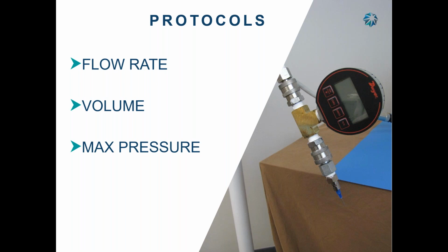Now you notice that these injectors up here are kind of torn apart a little bit, but they have an A and B. The CVI, did you see an A and B that we talked about? There is no A and B. That's for cath lab only. Why is there no saline? There's no need for it. Doctors don't need it in their study. They want full-fledged contrast going into that patient for better imaging.